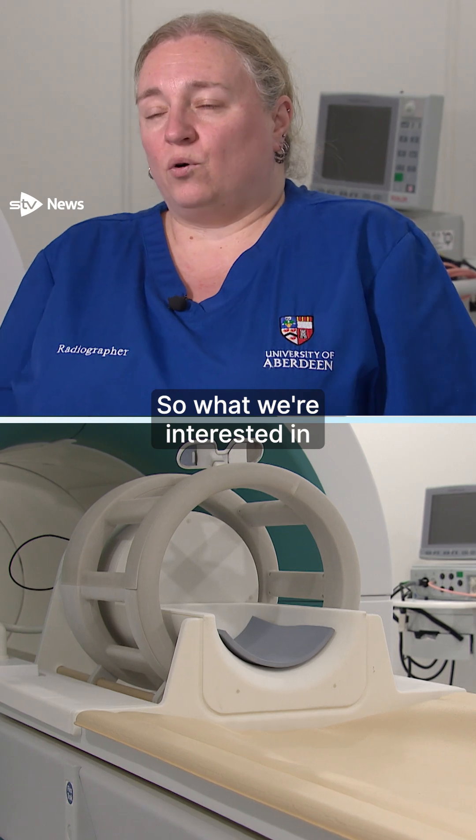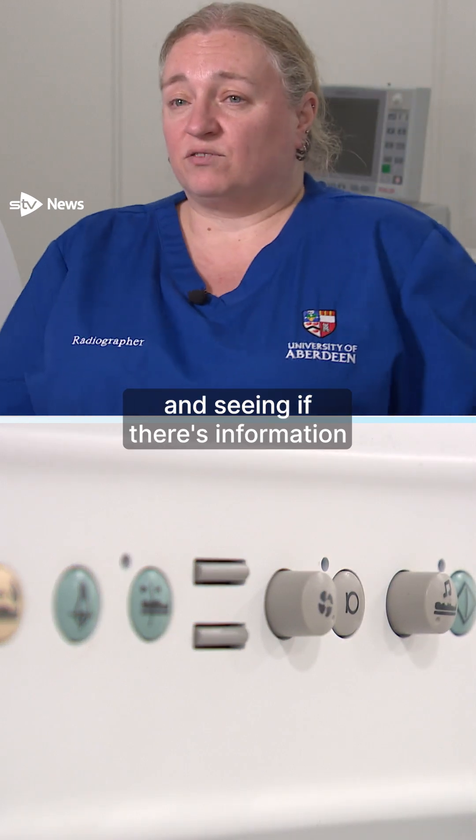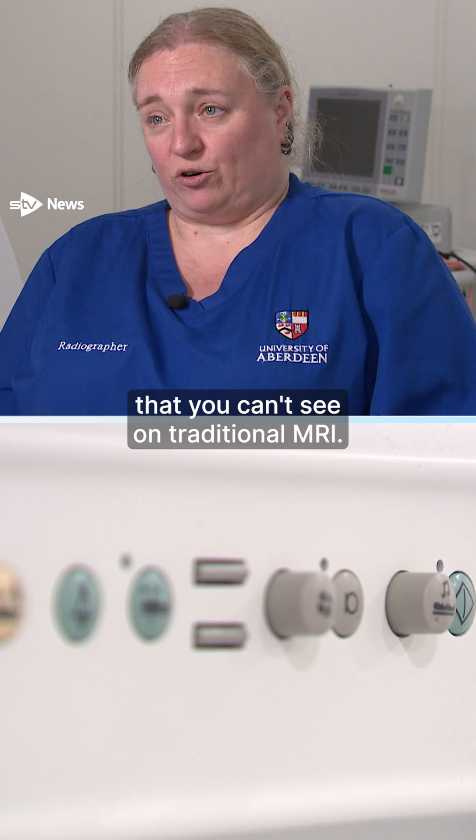What we're interested in with our scanner is looking at very low fields and seeing if there's information at the very low end of the field that you can't see on traditional MRI.